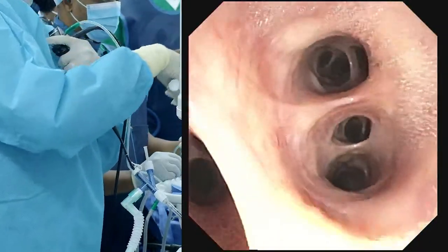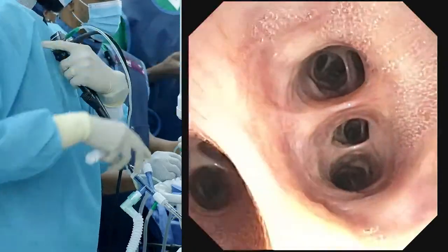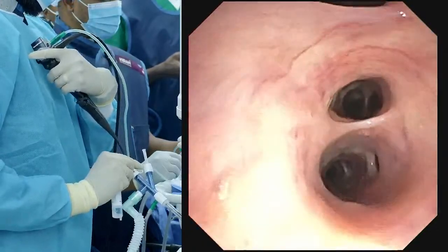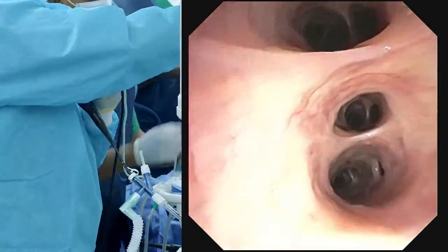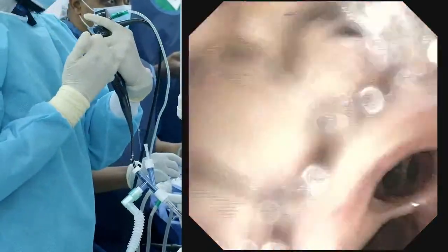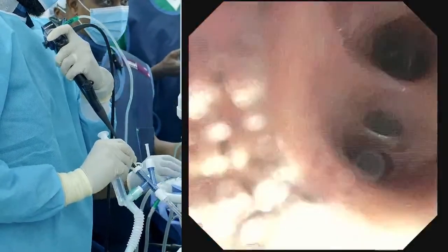Anterior, lateral, posterior basal segments. Yeah, any one of these two I think is okay. This is where it looked a little more dense. Posterior, go on. So I think even the balloon placement, if it gets into any bronchus, can go. Wash that area. Any of the two. And you saw how finicky placing that was last time. This is a good area. Shouldn't be a problem.